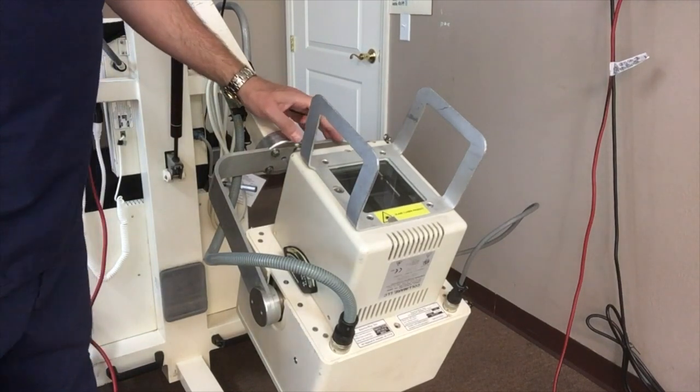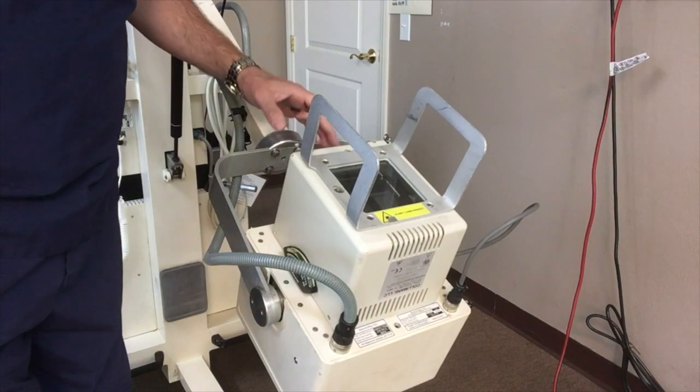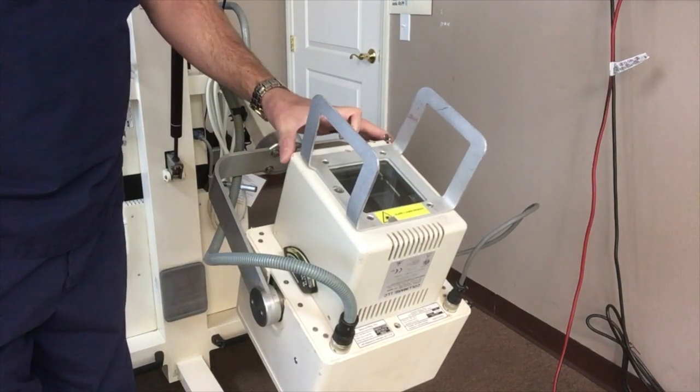I'm going to show you how to replace the collimator light bulb on the Source Ray 130. To do that we have to remove the knobs and the collimator housing.